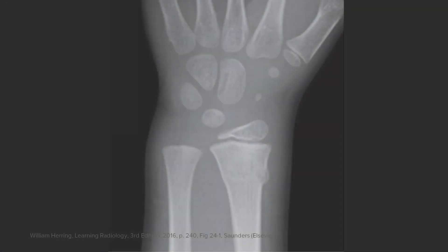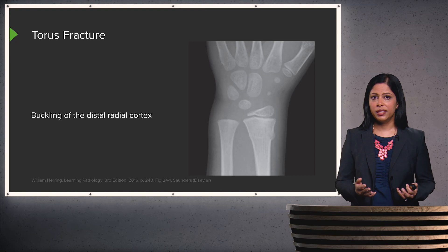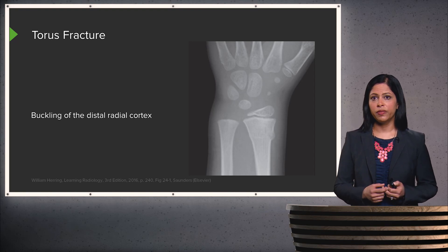This is another example of a wrist in a skeletally immature patient. You can see the growth plate open here, and the carpal bones are underdeveloped, which is commonly seen in the pediatric population as they develop over time. The abnormality is here — you can see a little buckling of the distal radial cortex that extends through, with buckling on the other side as well, which is slightly more subtle. This is an example of a buckle or torus fracture of the distal radius.